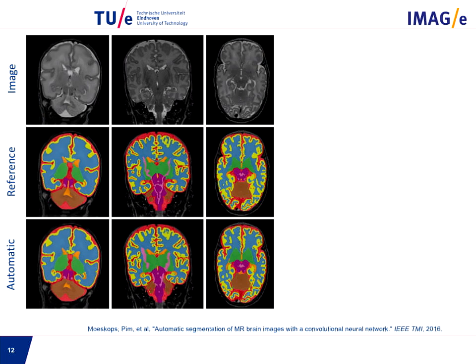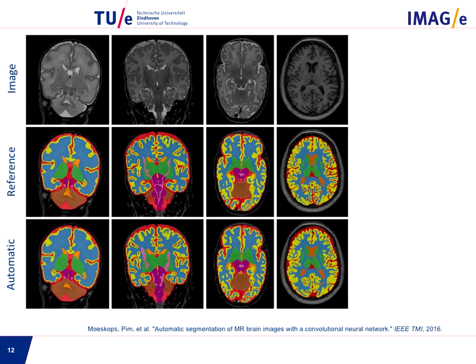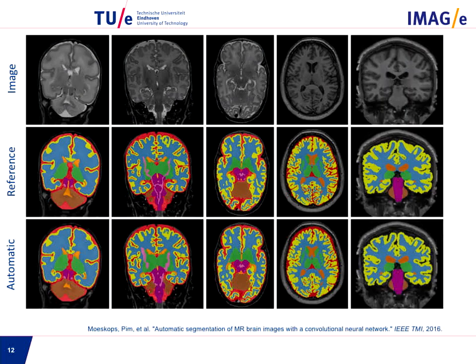Same things you can see. These are also images at 40 weeks of age, but just in the axial direction in this case. These are actually images of elderly patients of about 70 years old, and so we can show that we can use the exact same method to not only segment these infants, but also segment adult brains or elderly brains. And this is then another one of an adult brain, but in coronal plane.